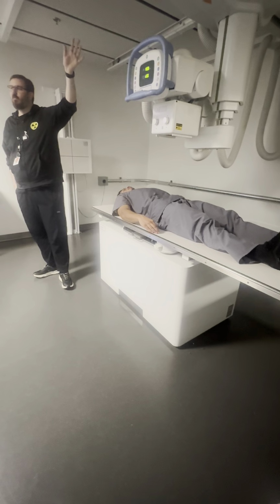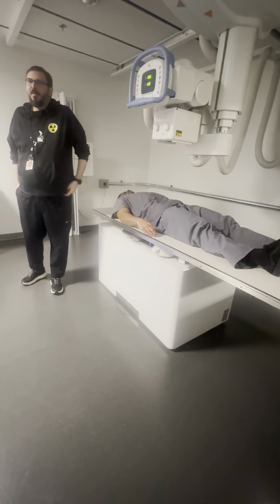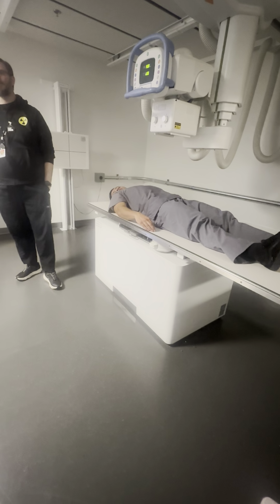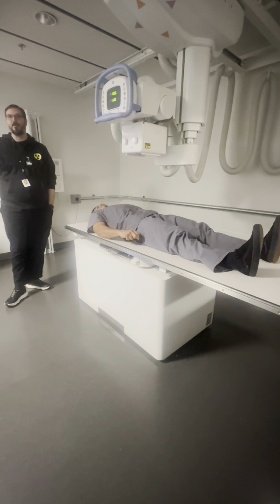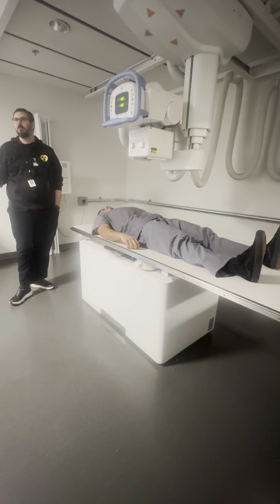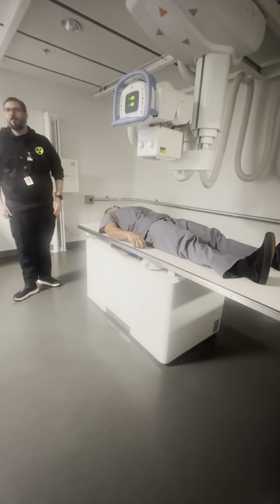Then once we see they're not having a reaction, okay, we'll come up in 3 hours and do the next shot. There was a patient who threw up the contrast twice, and we said, let's do this another day. And we just left. Problematic, is my point. Like I've told you guys many times before, what happens in the field is not what should happen in the field. You should not be giving contrast and taking your eyes off that patient until at least an hour. It doesn't happen in the field, guys.